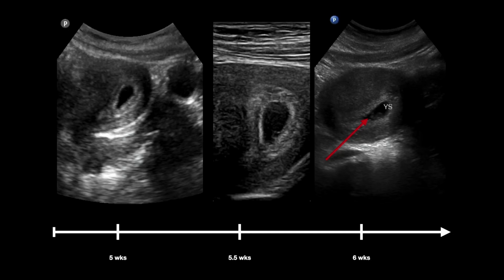Now, for me, in my understanding of the literature and general practice in the emergency department, I don't consider a double decidual sign to be dispositively convincing that this is a pregnancy, right? It is highly suggestive, and if you see that, you're less likely to be encountering other things.